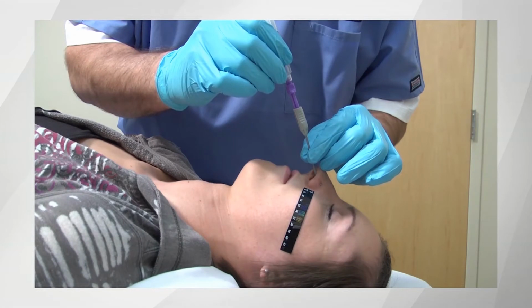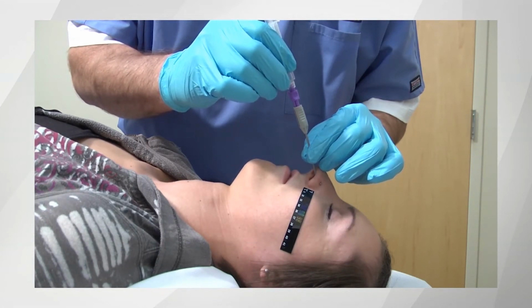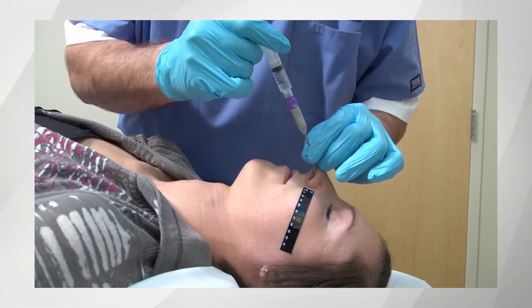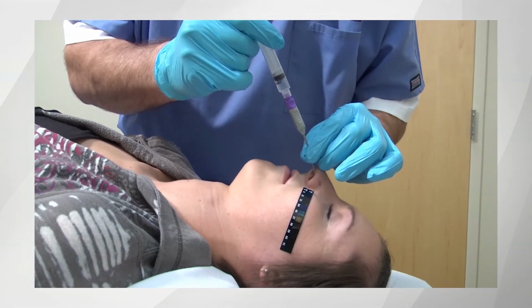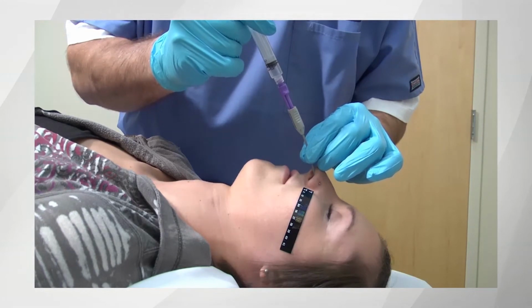Retract the inner catheter by separating the hubs. Pull the entire device back at least 1 centimeter. Then advance the device until nasal bone resistance is felt as previously instructed. Withdraw the catheter 1 centimeter. Deploy the inner catheter, and then begin injection when the patient is ready.